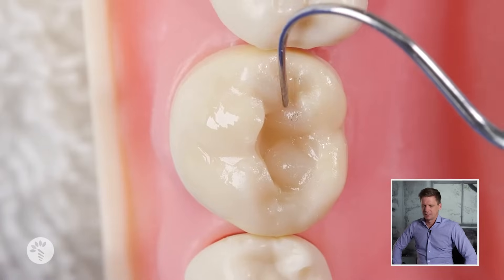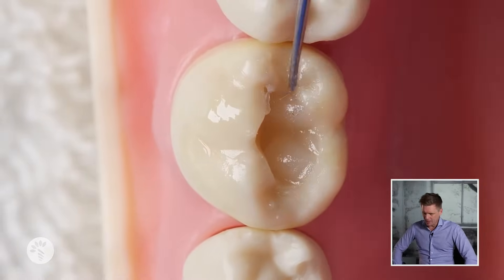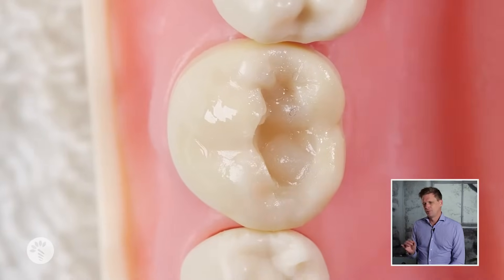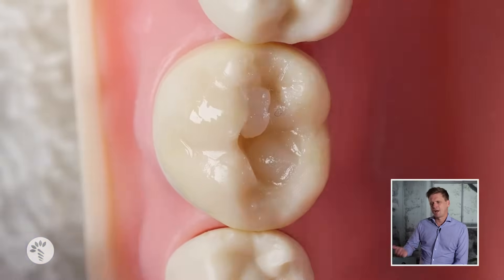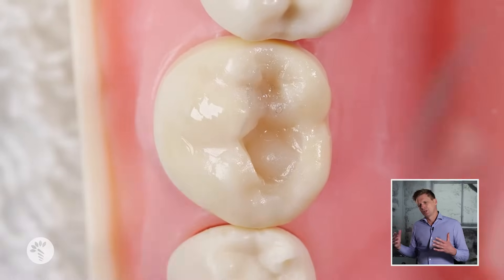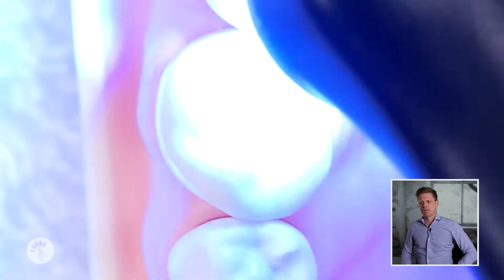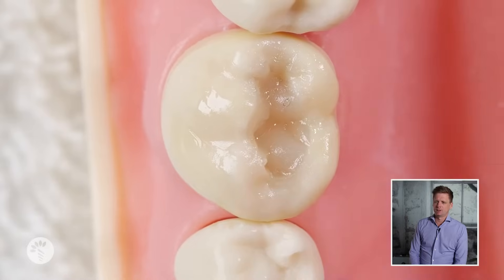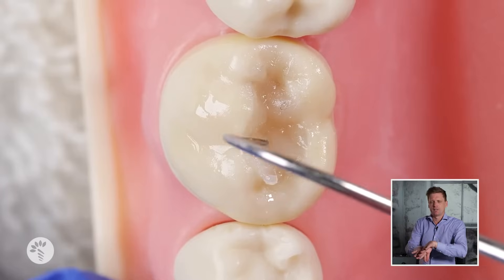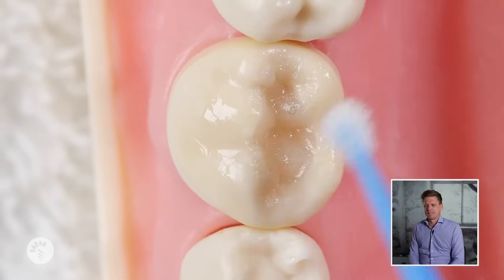In this particular tooth there's a fifth cusp — that little small one on the disto-buccal. You can see I'm using the probe to pinch off the excess; you can't push composite resin but you can drag it and pinch it off. If you push on both sides of a little blob of composite — one side then the other — it forms a little triangular top, and that's how you get a pyramid-shaped cusp. A fissure pattern is just two inclines meeting; you don't design a fissure, you design the inclines, and where they meet you have a fissure.